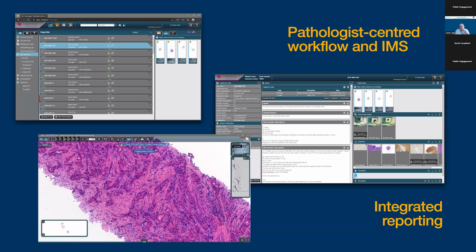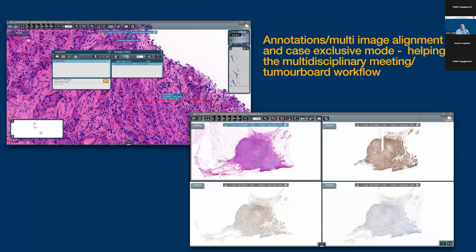relevant diagnosis. We have got a ton of different tools now. We have got multi-image view, synchronize, and annotations, which can be, in inverted commas, favorited for the multidisciplinary meetings, enabling us to jump on the relevant parts of the images very, very quickly, or doing Ki-67 counts on any part of the image, or doing measurements, mitosis count.